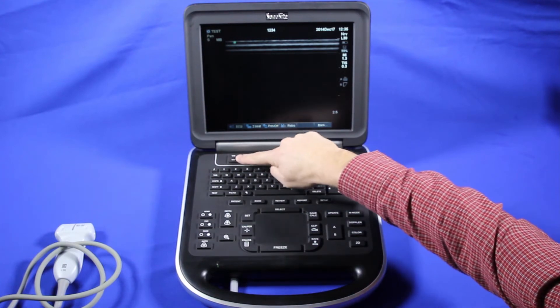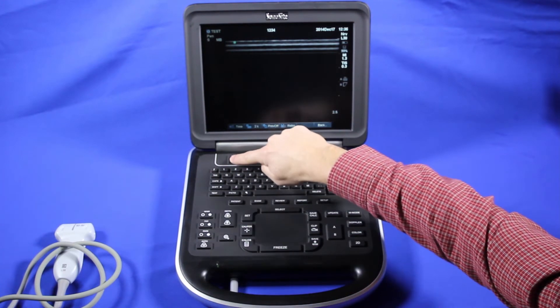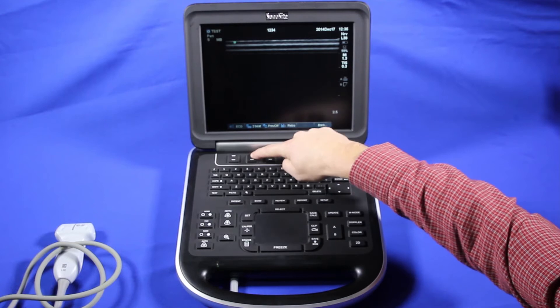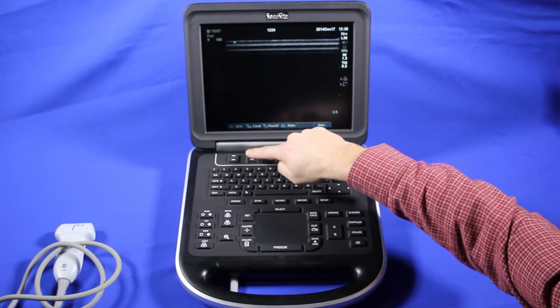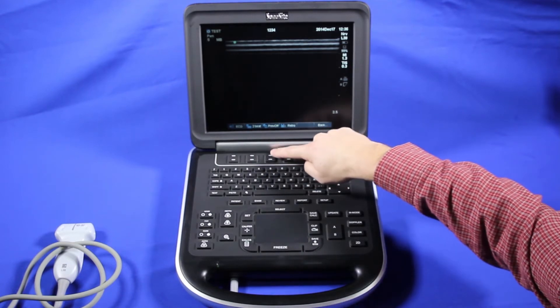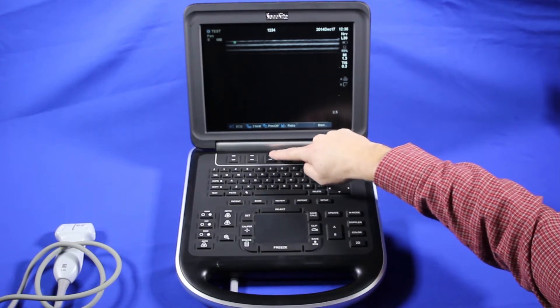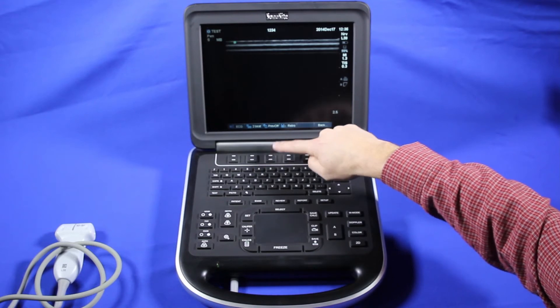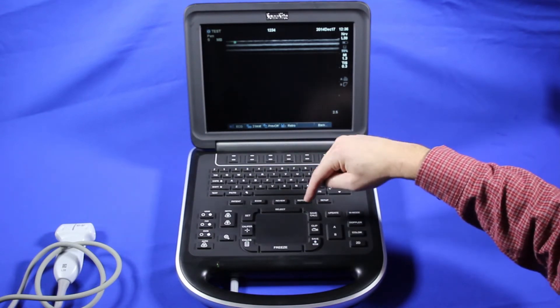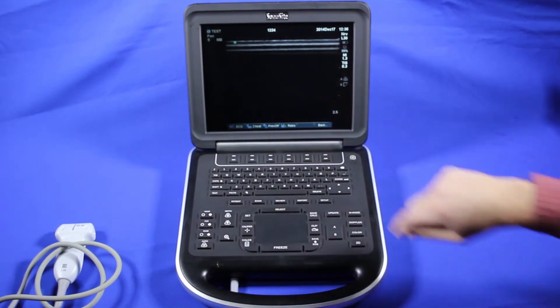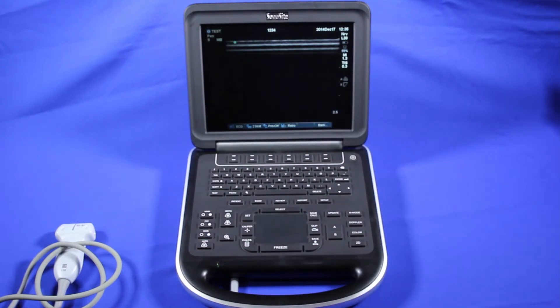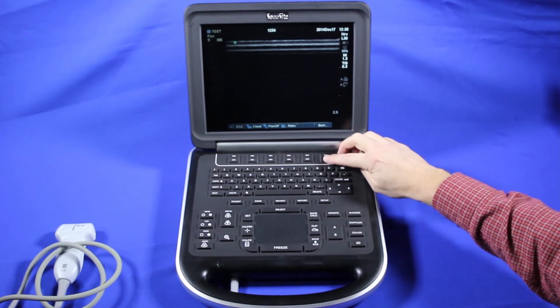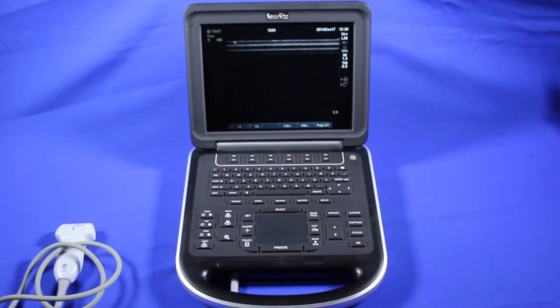If I want to select by heartbeat, I would choose ECG, and it's going to let me choose how many beats I want it to save. With preview on, once I freeze or hit the clip, it's going to show me whatever it is that I'm looking at. I'll go back to the main page.